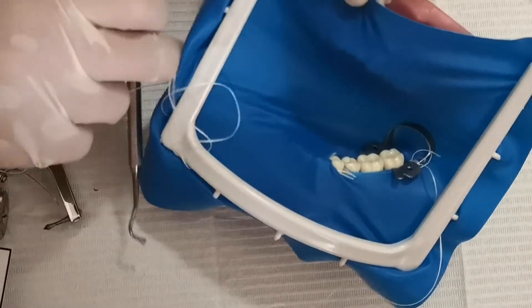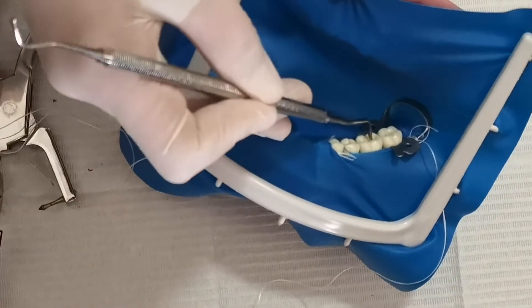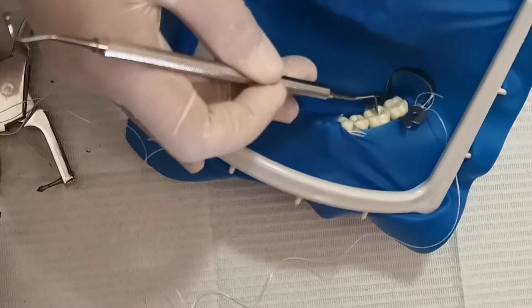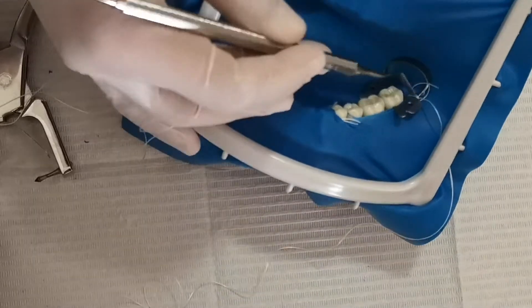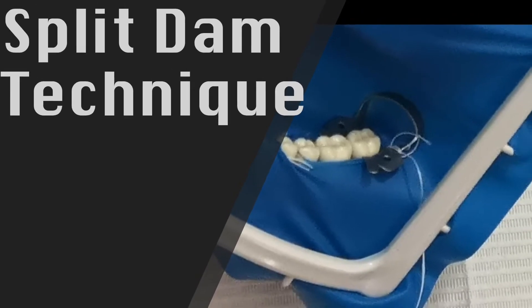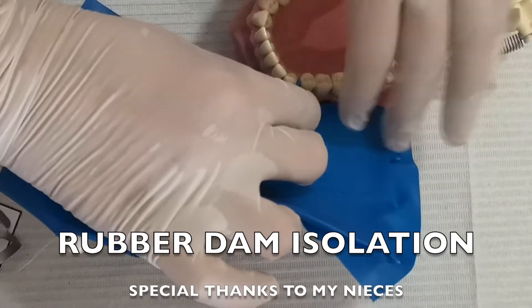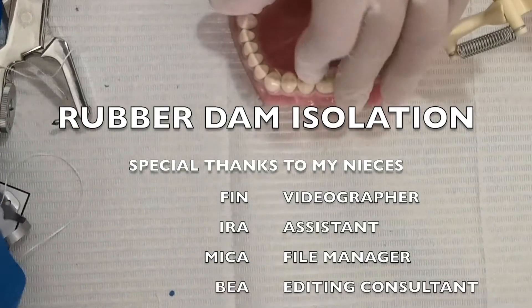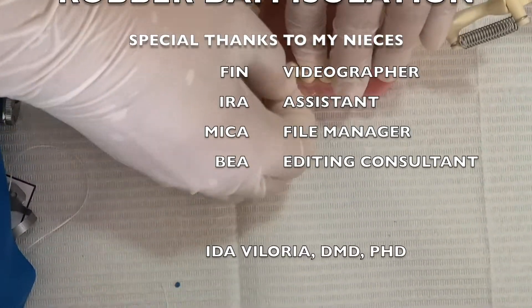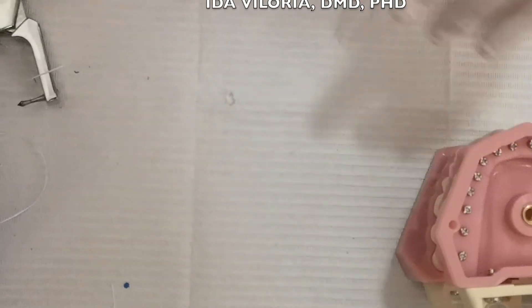This is the split-dam technique, where in this case — imagine that tooth 36 does not have enough tooth structure where you can place the clamp. My technique is simpler.